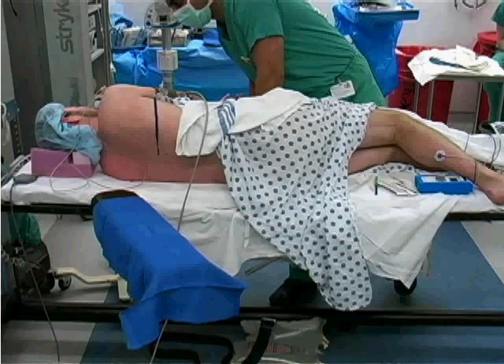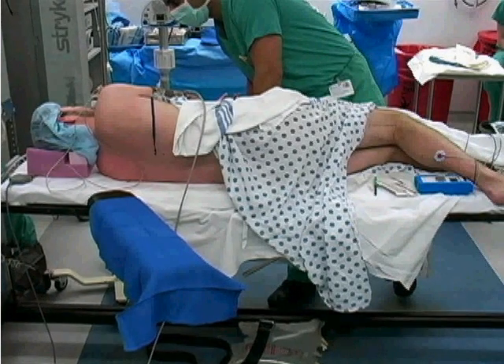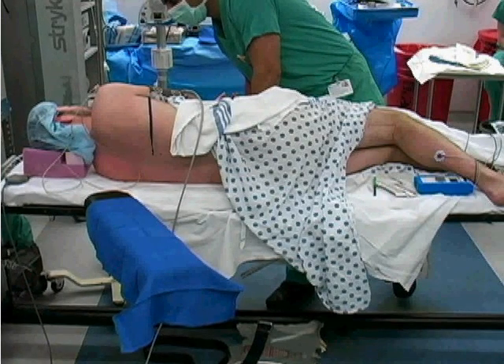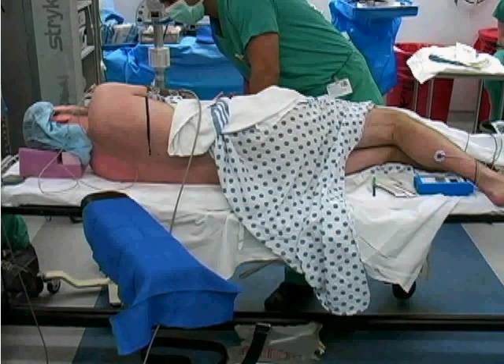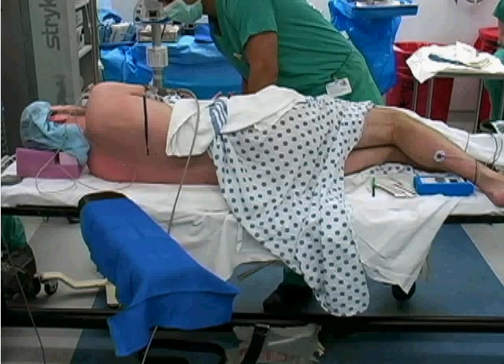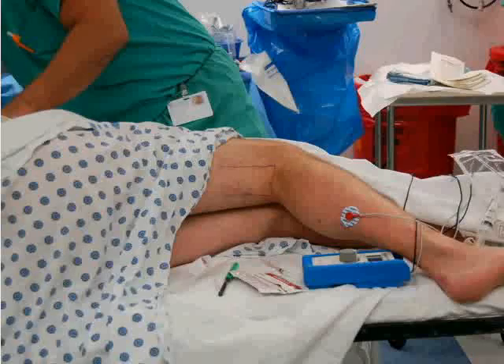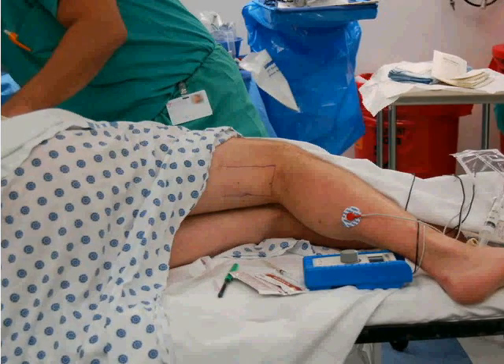Place the patient in the lateral decubitus position with the leg to be blocked superior to the contralateral leg. The lower leg and foot need to be easily visualized to appreciate the muscle twitches generated by the nerve stimulator. The electrode should be placed on the patient's leg to complete the electrical circuit. Ensure that the posterior surface of the patient's leg is well exposed.